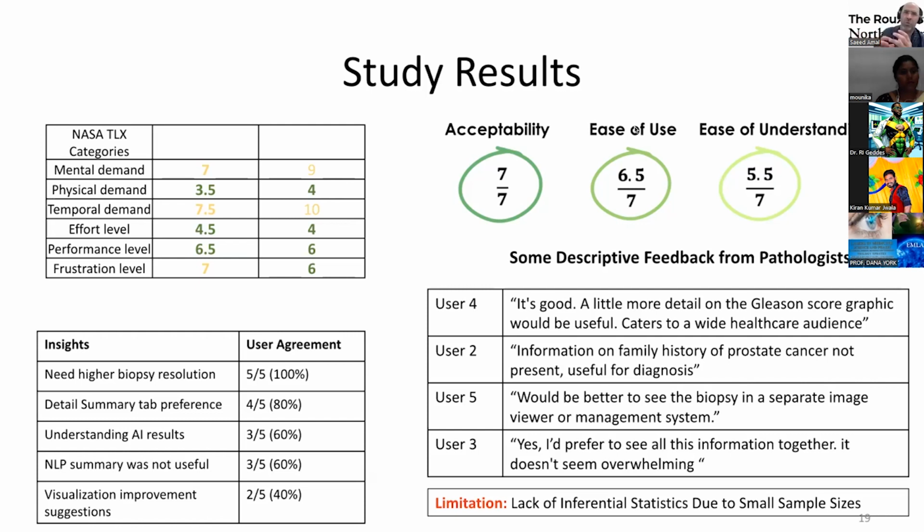So in this case, we show some additional information about the patient, a summary about the patient. We show the biopsy, and we have what we call evidence-based diagnosis, where we also show segmentation at the pixel level and at the patch level. We do the pixel level in terms of grading of the Gleason score, because the ISUP grade is at the biopsy level, the whole slide image level. When we take pixels, we use the Gleason score, which is based on the Gleason pattern.